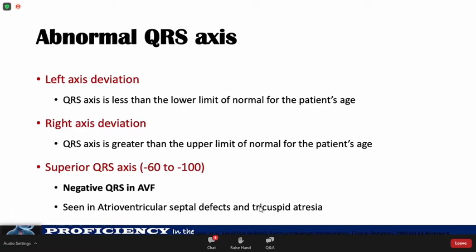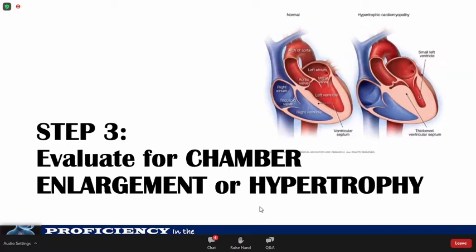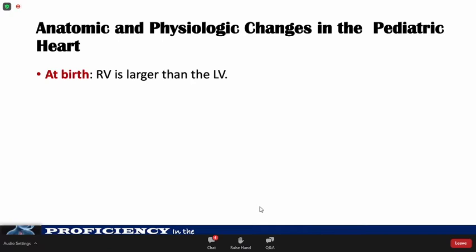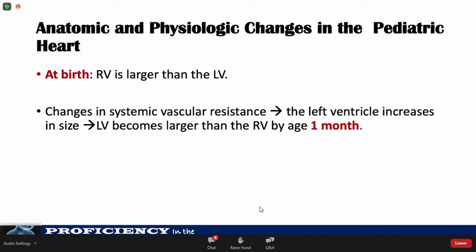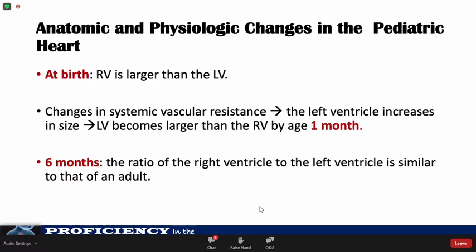We are now done with rate, rhythm, and axis. Next is to evaluate for chamber enlargement and hypertrophy. The right ventricle is generally larger than the left ventricle at birth. Through changes in systemic vascular resistance, the LV eventually increases in size and becomes larger than the RV by 1 month of life. At 6 months of life, the ratio of RV to LV is already similar to that of adults.